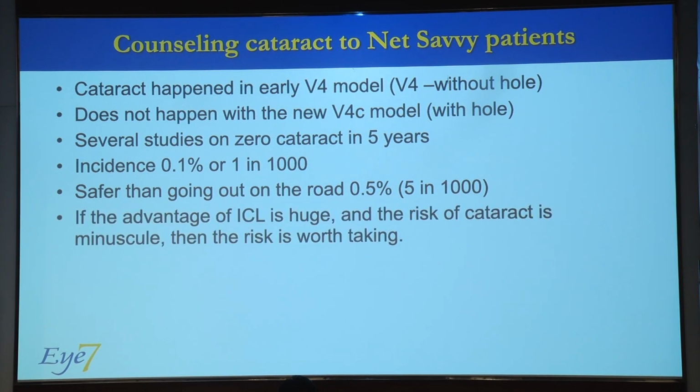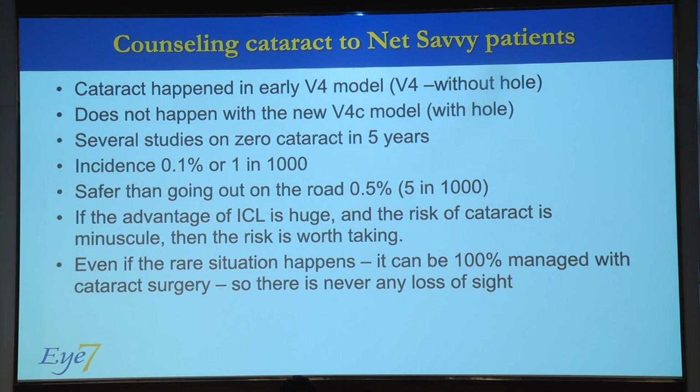So if the advantage of implanting ICL is huge and the risk of cataract is minuscule, then this risk is worth taking. And even in the rare situation where cataract does happen, it can be managed 100% with cataract surgery. There is never any loss of sight.